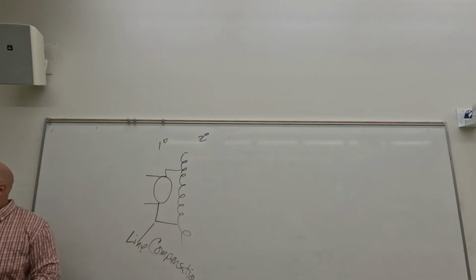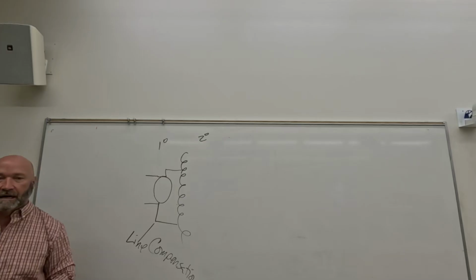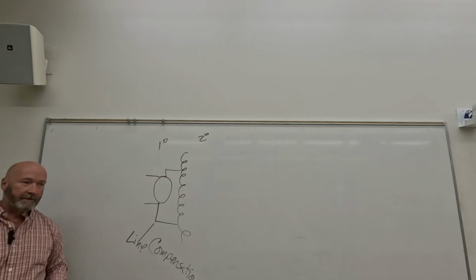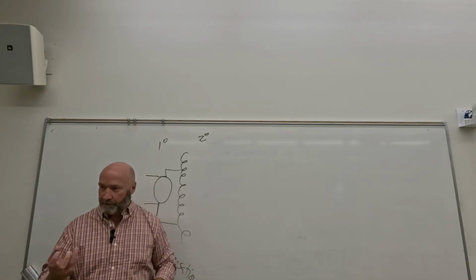Yep. All right, so general purpose, again, the RF room is most flexible. Radiography just has an overhead tube frame, but for fluoroscopy, if you're in an RF room, it's got a second tube, and that tube is inside the table. The thing you pull across the patient is not the X-ray tube, that's the image intensifier. Okay, so you're actually shooting from under the patient.